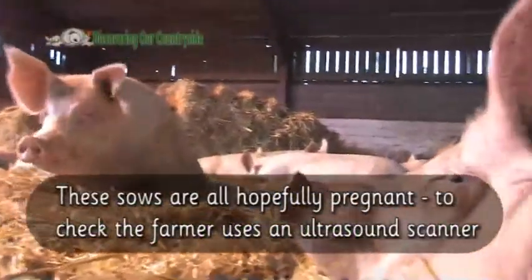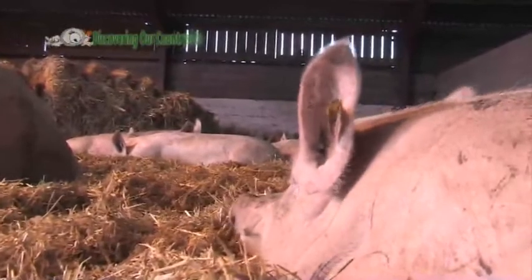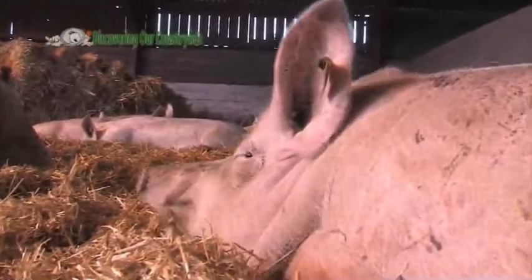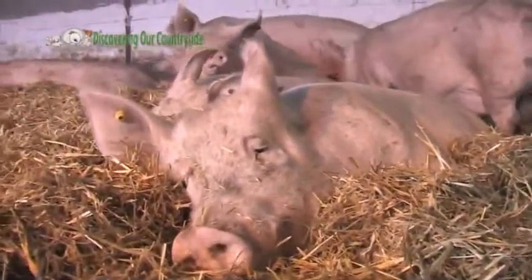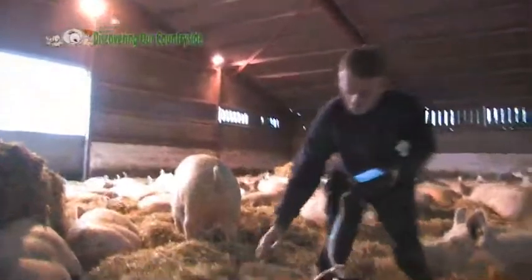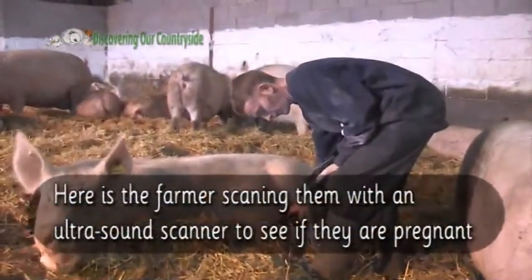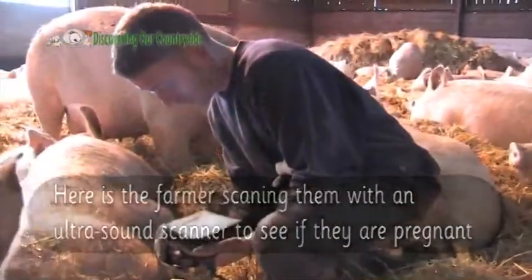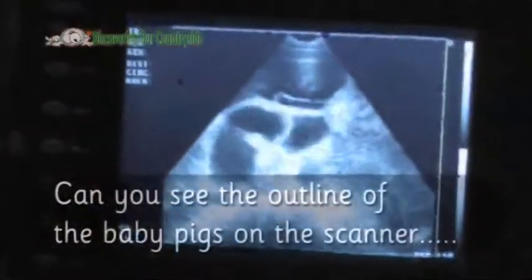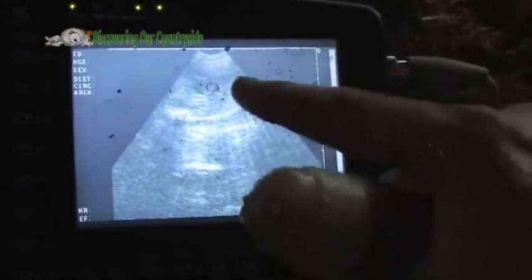These sows are all hopefully pregnant. To check, the farmer uses an ultrasound scanner, just like the ones used on humans. Here is the farmer scanning them with an ultrasound scanner to see if they are pregnant. Can you see the outline of the baby pigs on the scanner? Just the background of the piglet there — you can see the ribs.